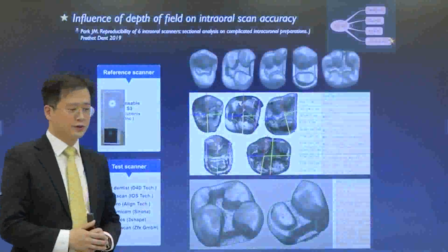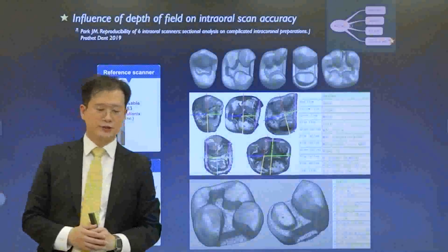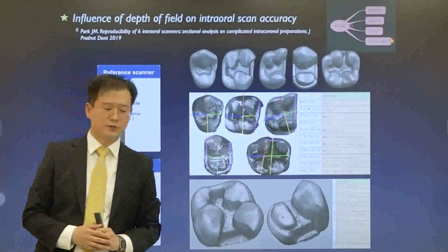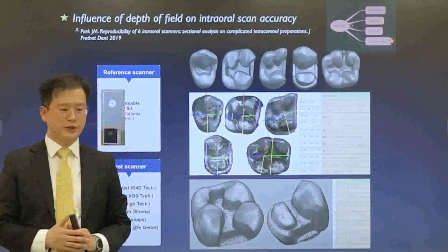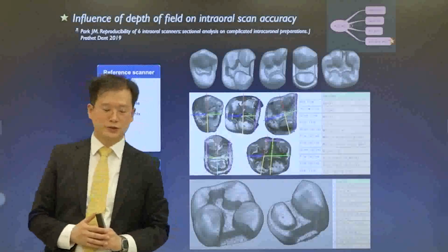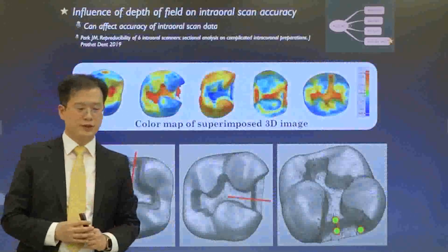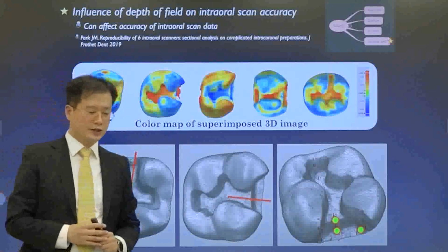Another aspect of the accuracy of the intraoral scanner is the maximum scan range in reaching the deepest part of the preparation. I occasionally suffer from not being able to acquire a complete scan at a narrow and deep inlay box or crown margin, which is next to a long adjacent tooth. Therefore, to evaluate these parts, I evaluated various intraoral scanners for complex inlay preparations.